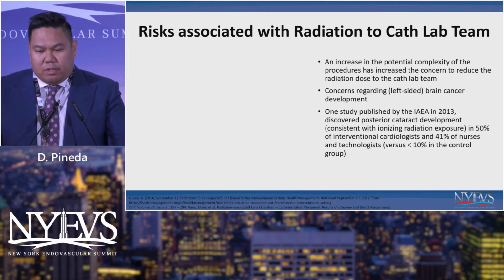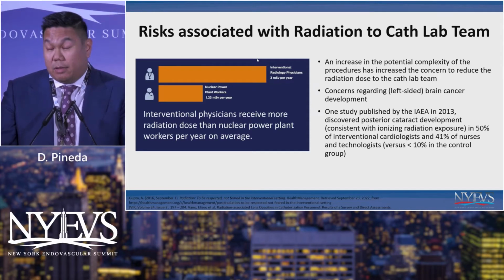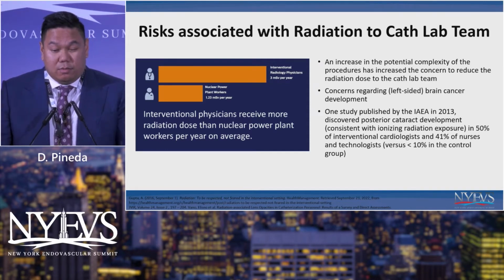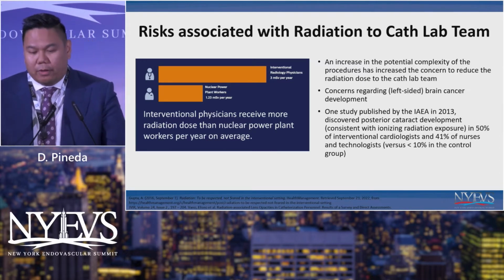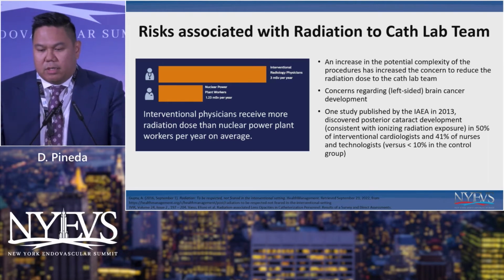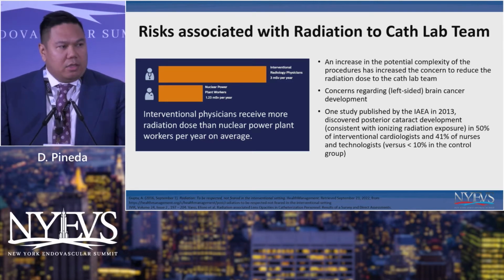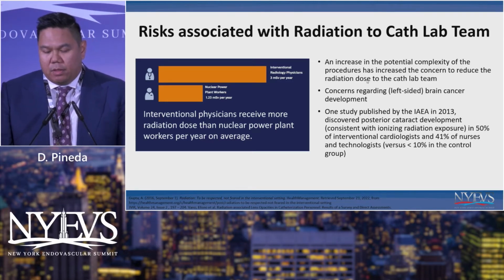Regarding the risks to the cath lab team, in my poll earlier, physicians actually get more than double the amount of radiation of a nuclear power plant worker. So it's really important for us as staff to support cases appropriately, use less dose, and protect ourselves and our patients.